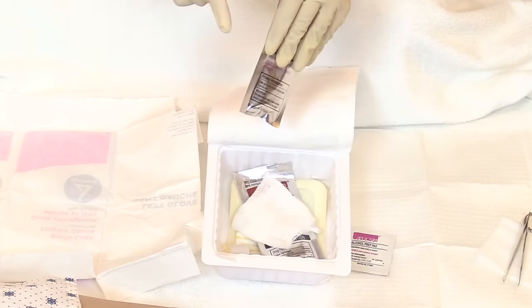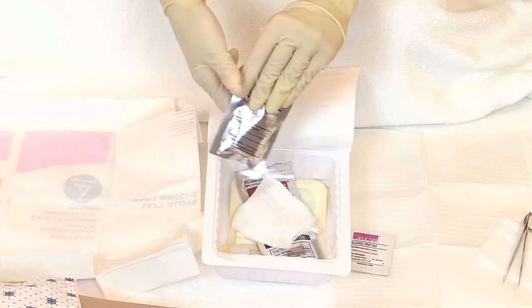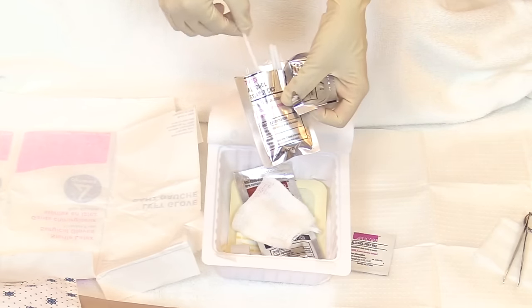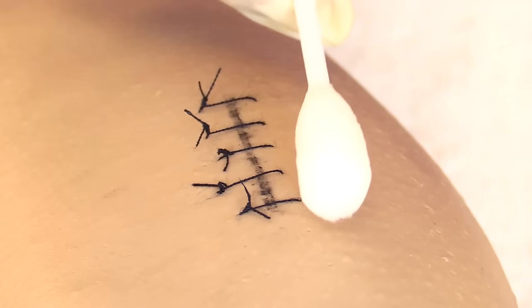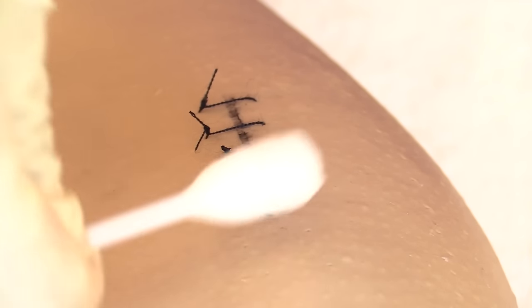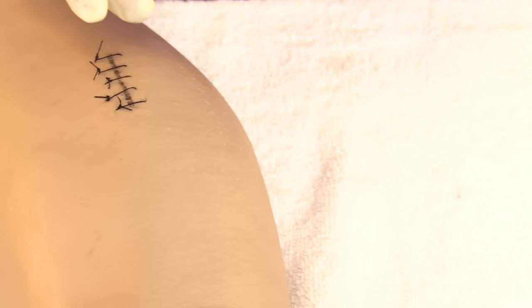Now open the antiseptic, which we'll use to clean the wound before and after suture removal to help decrease infection. Inside you will have three swabs with antiseptic on them. Take an antiseptic swab and clean along the wound to prevent infection, then discard the swab and let the area dry.